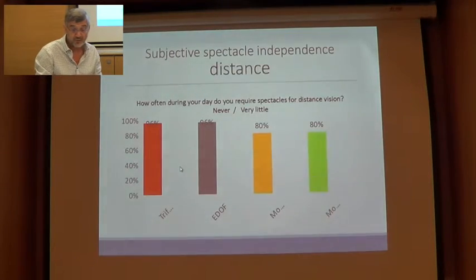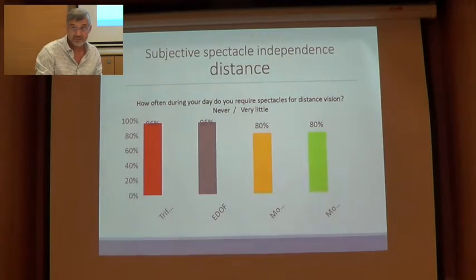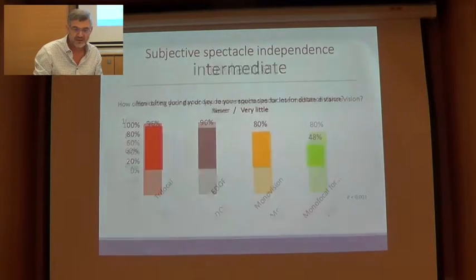Number 1, patients with premium lenses are pre-selected, unlike patients that we are doing monofocal, which probably are older and are not as well selected. And the other thing is the workup that we do with these patients. When we have a multifocal lens and we do refraction, at least 2 biometries, and we look at corneal topography, OCT, and so on. So we use multiple formulas. So the workup of this patient is by far much better than this, in which we use just one of the biometers and just a few formulas. So probably the workup does make a difference.